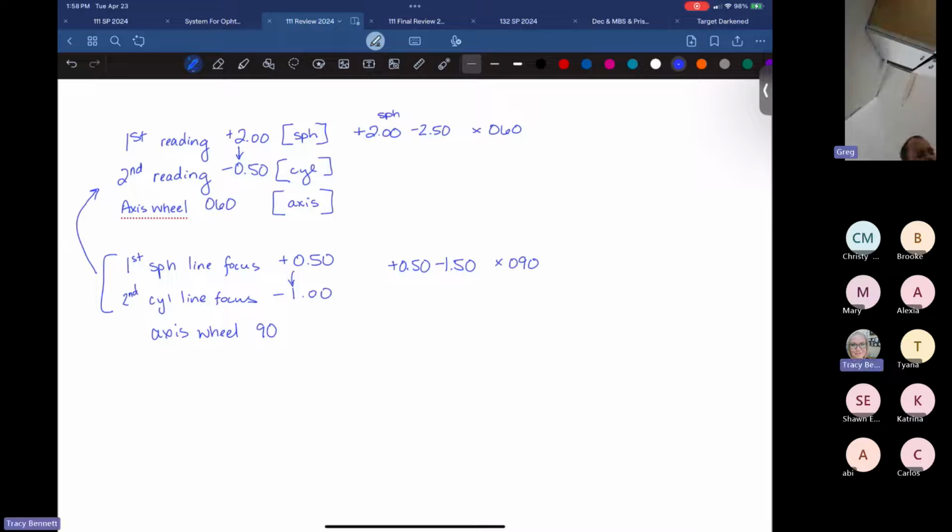At the OC or the major reference point. Very good. Yes. So we measure the thickness right there at the OC, and it measures the center thickness or the thickness of the lens in millimeters. So being able to read that thickness gauge is important.